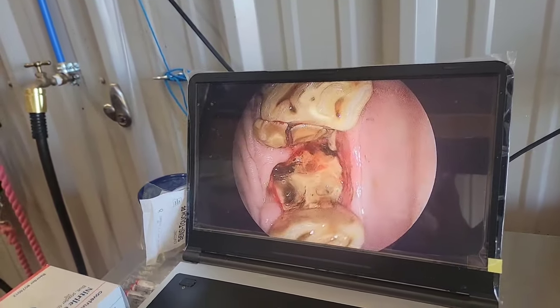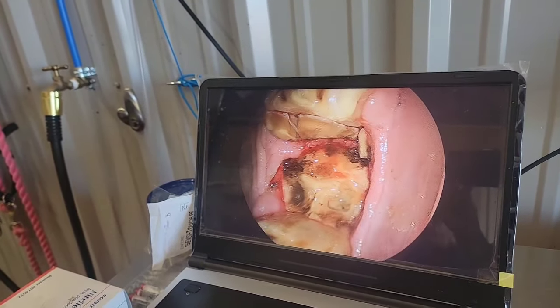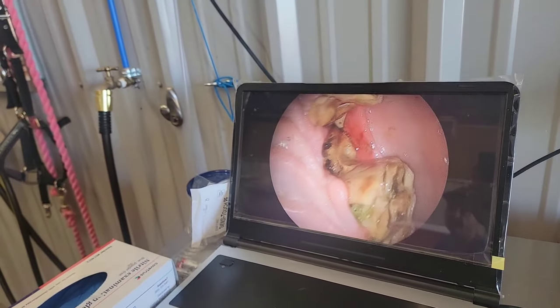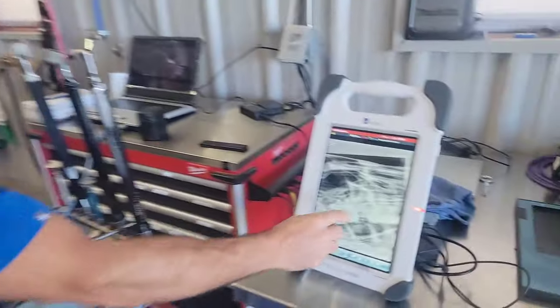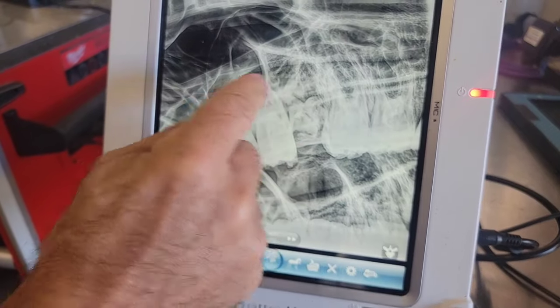We can see this tooth is broken — there's really nothing to grab a hold of. And then on the radiograph, it was actually trapped. We can see right here how these other teeth have closed in and this tooth is trapped in. So we're going to show you guys how we're going to do it.